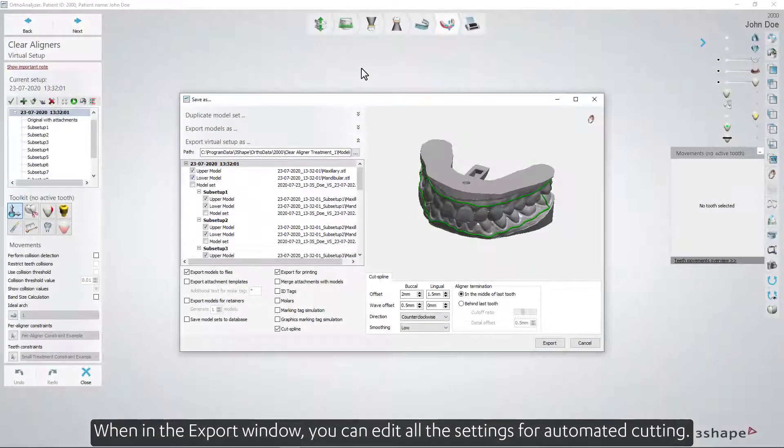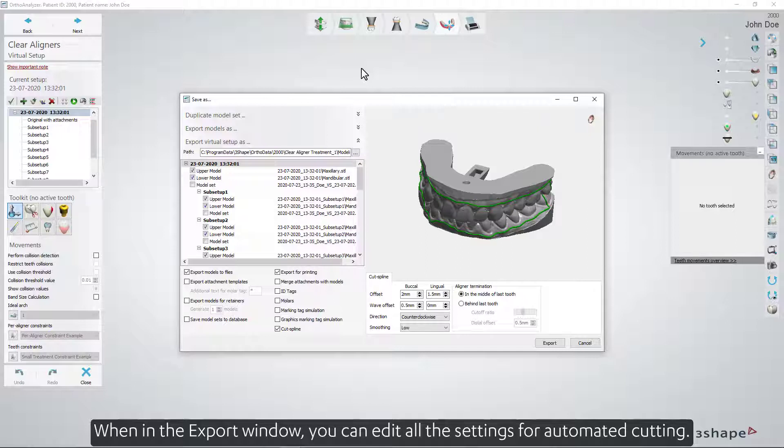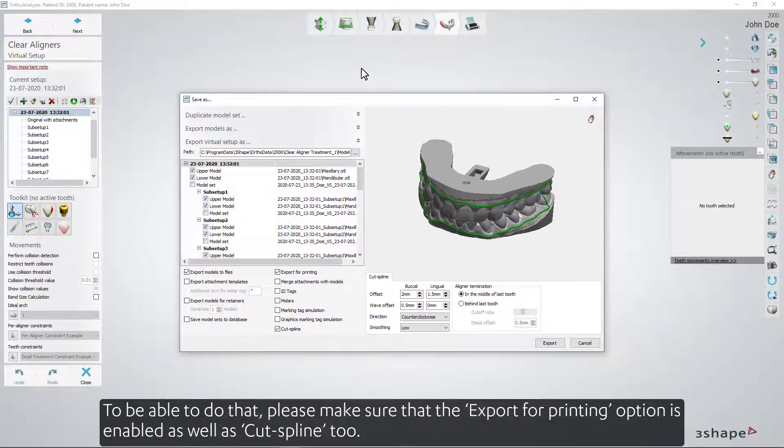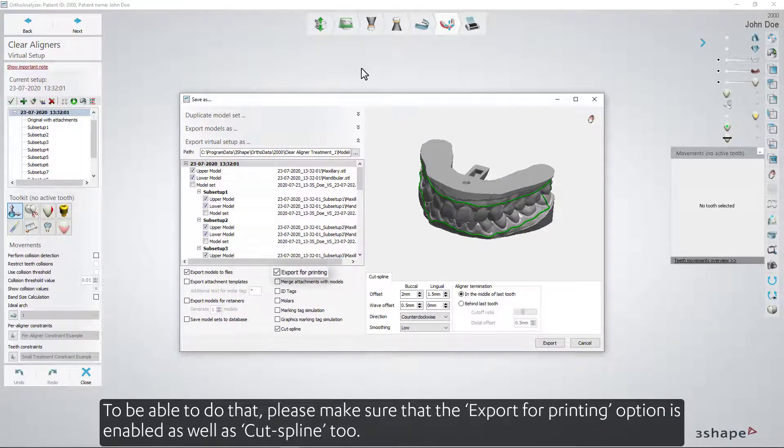When in the Export window, you can edit all the settings for automated cutting. To be able to do that, please make sure that the Export for Printing option is enabled, as well as Cut Spline 2.